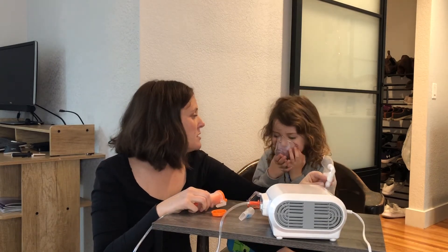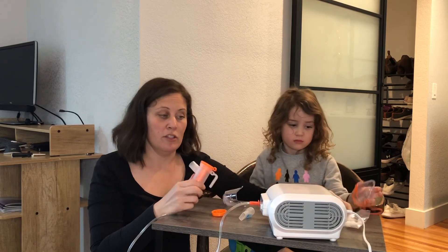The adult mask is for if your face is bigger. We also have some filters that go with it too.